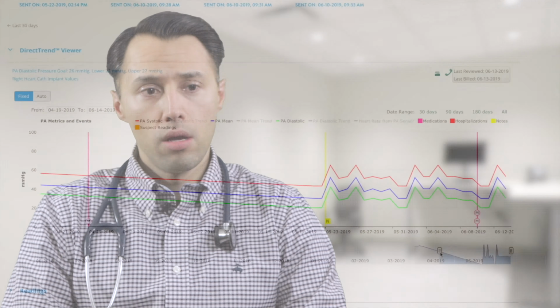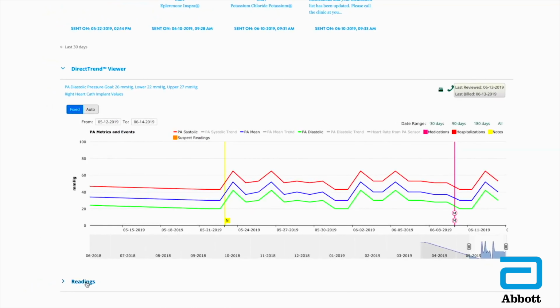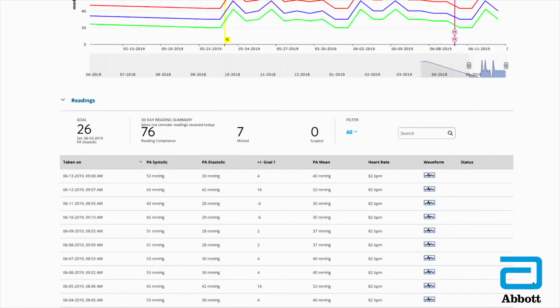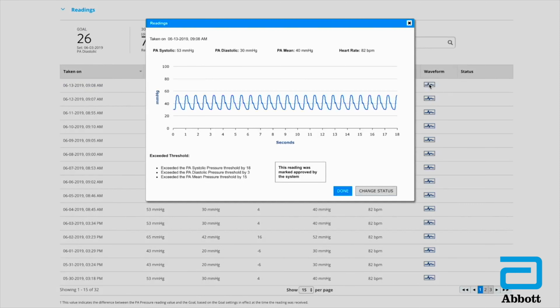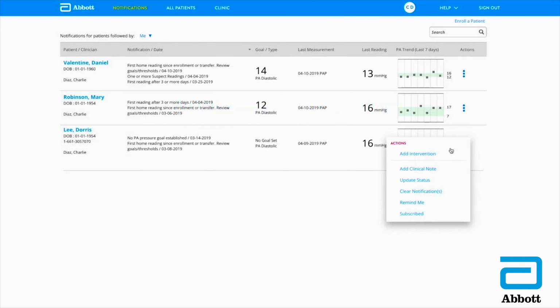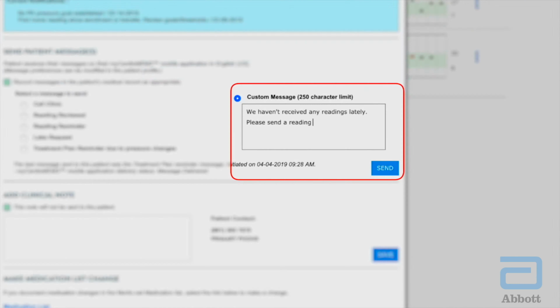There's a lot of assumptions with increases in weight, and with this device, we measure the exact pressure in the lungs. We have a set target in the software after which it alarms, and if the patients go above that target for a certain number of days and they're sustained, then we're able to call them and make a change. We have specific protocols depending on how high above the target you are and how low above the target you are, so that we can adjust medications up if we need to, we can adjust them down if we need to, to make sure that we avoid that next hospitalization.